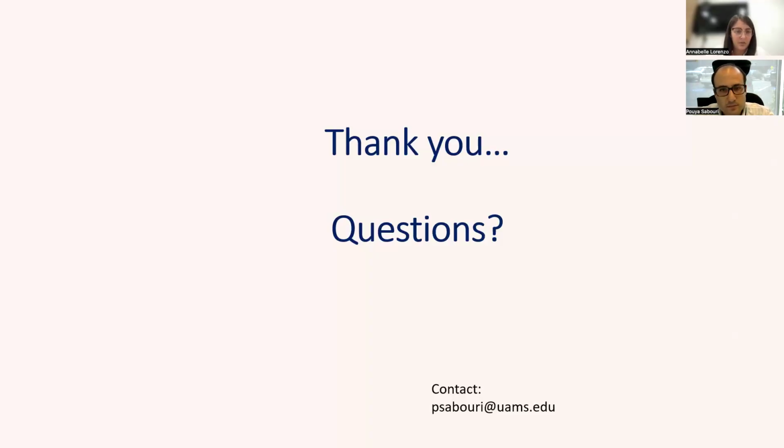How did you take a breath hold CBCT on proton machine, for example, IBA, Proteus 1, or Proteus Plus? This study was performed on the Varian system, and one of the things that we did test was that some patients may not be able to hold the breath hold during the entire duration of the CBCT, and at that point, you do pause the scan and resume once they enter the breath hold again. Or you can use a half fan scan to get a faster acquisition and so on.